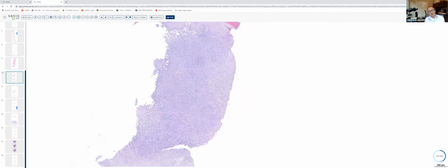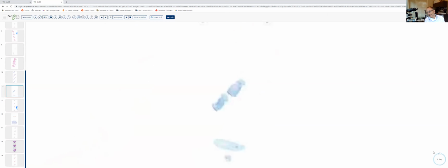So in that case, we're relegated to call the clinician and find out about the clinical history. This patient had a few nodules on the arm. And of course, we're going to get PAS, GMS, Fite, and/or AFB, and frequently tissue Gram stains. And in this particular instance, and again, you didn't have this slide available for review, this was a Fite stain.